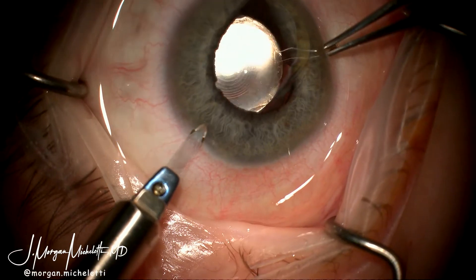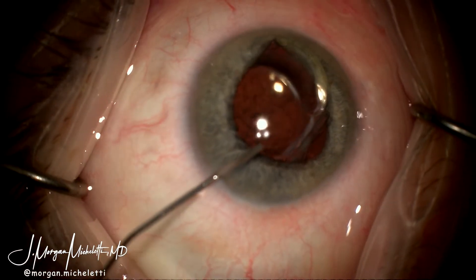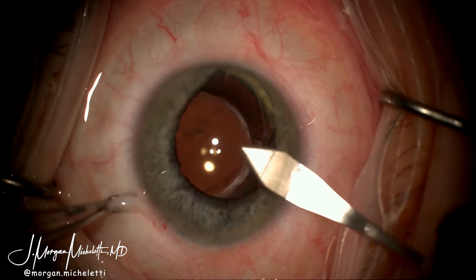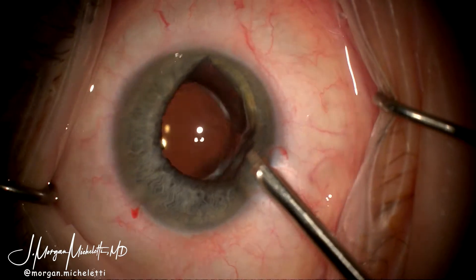After discussion with the patient, the plan was to try to salvage this lens and to recenter it. Two paracenteses were created and the eye was filled with Viscoat. A 2.4 millimeter steel keratome blade was used to enter the anterior chamber and the IOL punch was inserted.